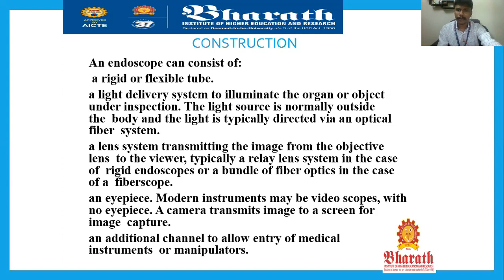The light source is normally outside the body, and the light is typically directed via an optical fiber system. Why is it known as an optical fiber system? It carries light rays from outside to the inside. So it is considered an optical fiber system.